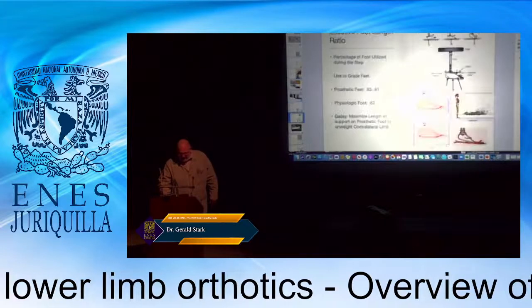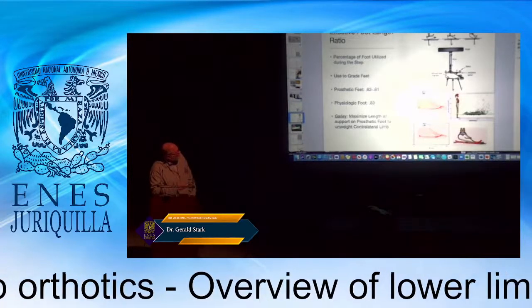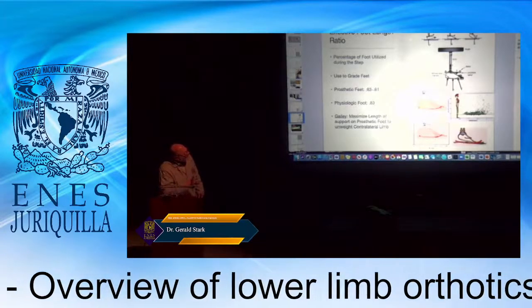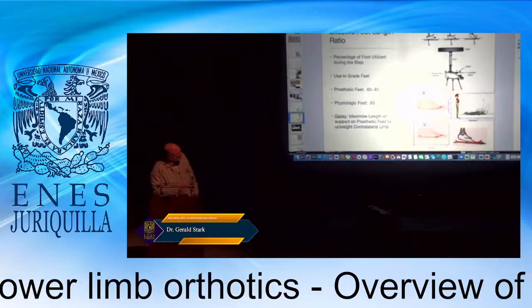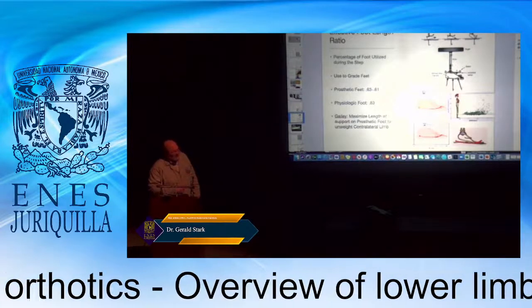And that describes for us how things move. This has also been mimicked in terms of how, if you put a weight on a foot, a dumbbell or a heavy weight, 40 pounds, and then rock over the foot, you can see the same type of rollover shape. This also shows us the effective foot length.